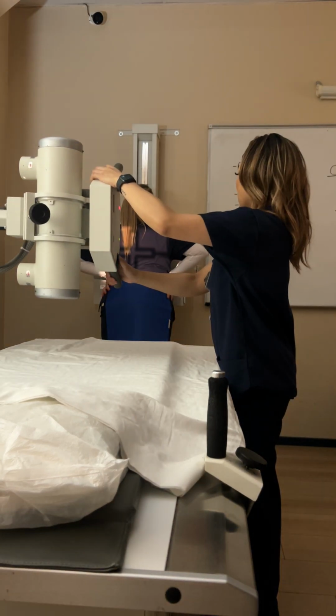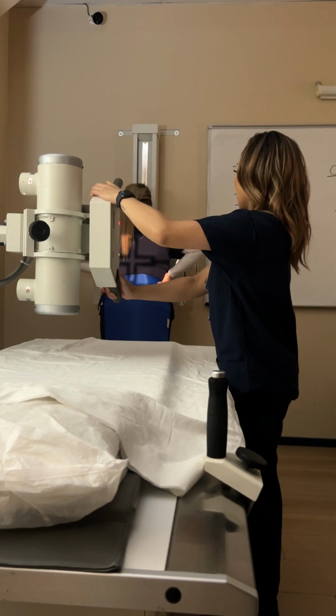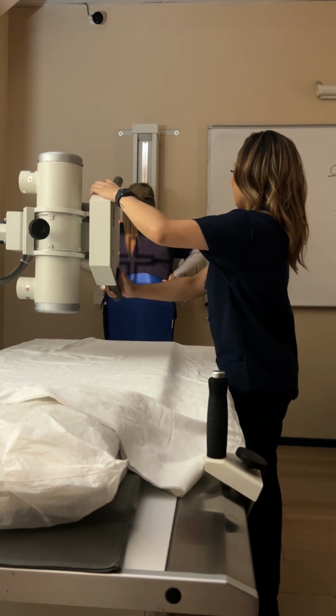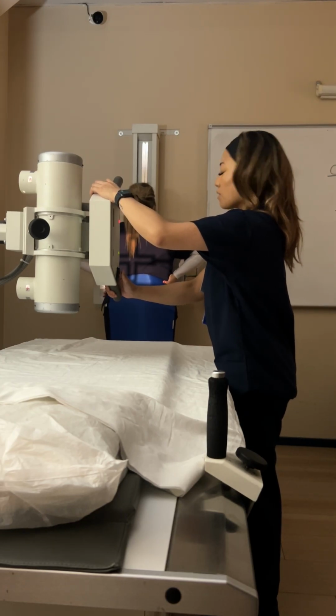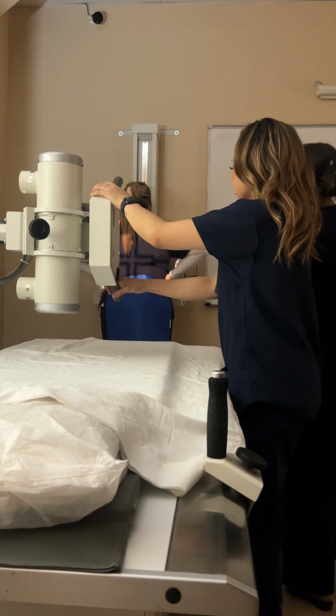Sure. So remember, when we send something to the radiologist, it needs to be in what orientation? Anatomic, as though the viewer is looking at them, right? So, for example, if I shot Victoria, PA, right? Sorry, what's your name? Kayla. If I shot Kayla, PA, my left marker would be on her left side, same as me, right? The image would then look like this.